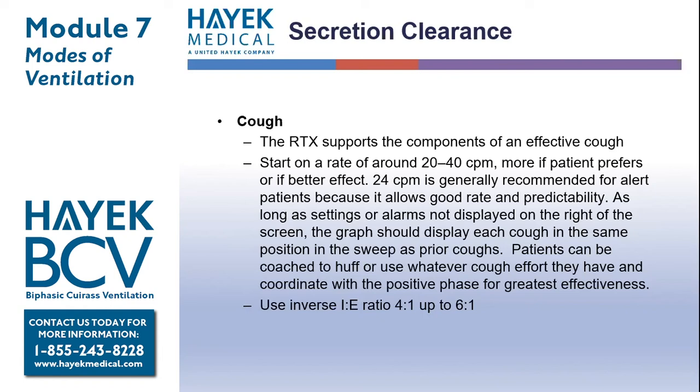As long as settings or alarms are not displayed on the right side of the screen, the graph should display each cough in the same position in the sweep as prior coughs. Patients can be coached to huff or use whatever cough effort they have and coordinate with the positive phase of the cough assist for greatest advantage.